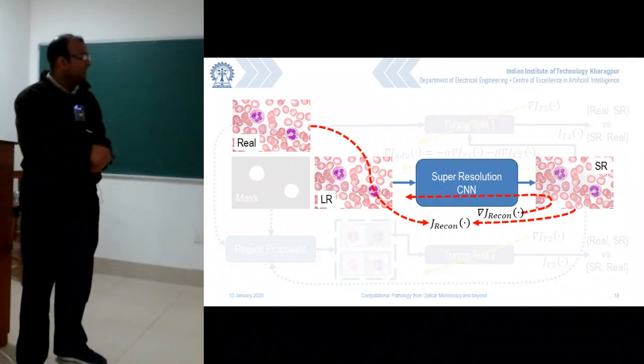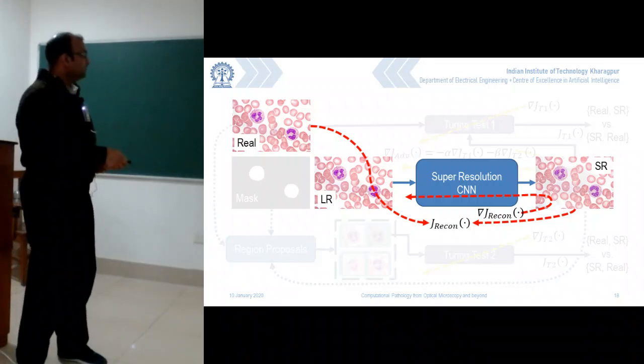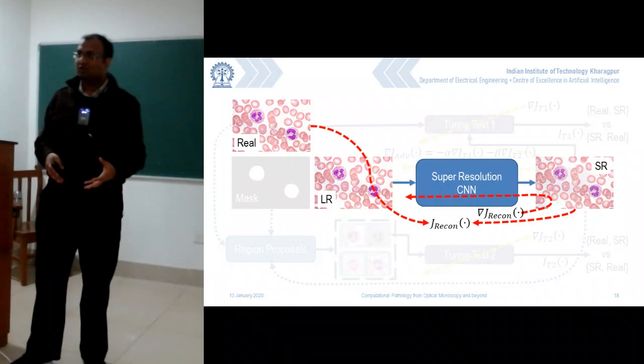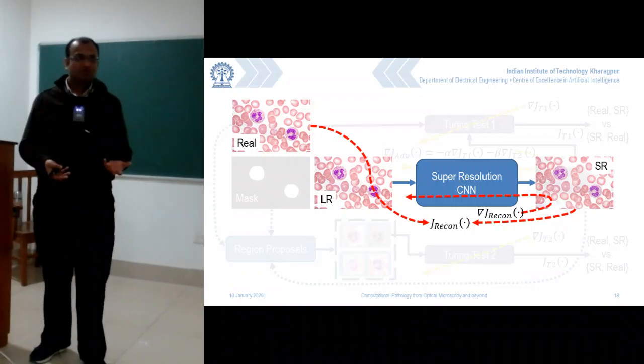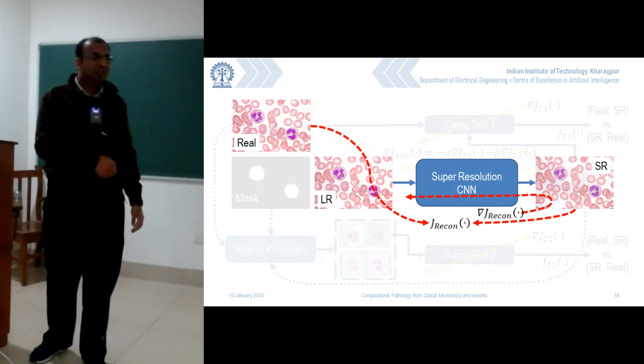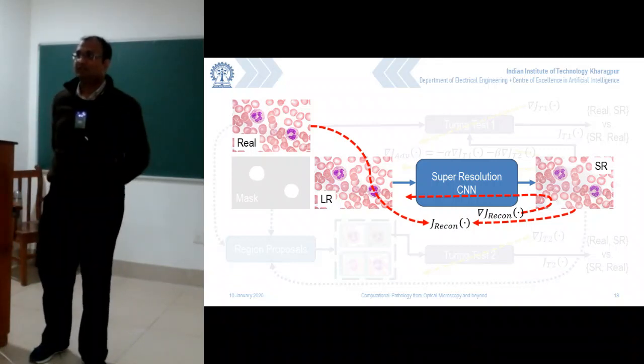Now when you take an average value over this whole error metric between the super resolution SR and the real, where the majority of places, because they were almost flat, gave you 0, you tend to believe in the average case that your error is low. Here also the same thing happens. So your error can go low, but these textures will not be reproduced properly.